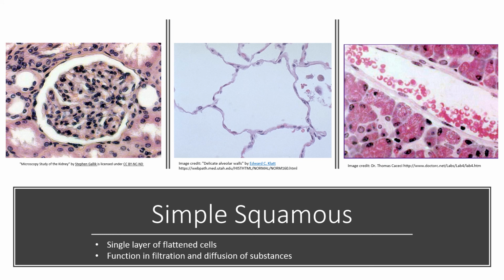So the first place we're going to see it as an example is here at the glomerulus. Do you see how there is like a line that goes here, and then there's like a little bulge? Line, line, line, line, all the way here, forming the lining of this glomerulus, and then here's another bulge. Line, line, line, bulge.